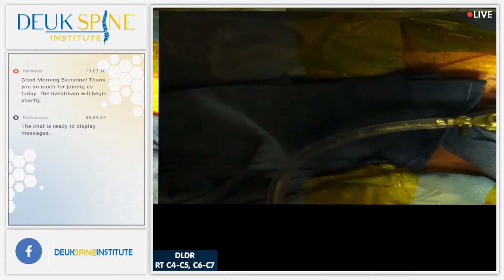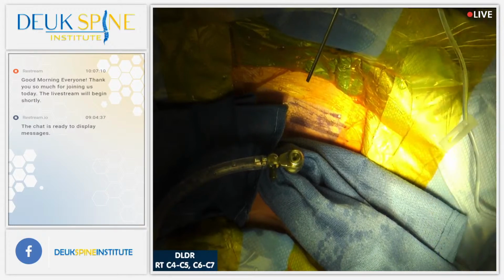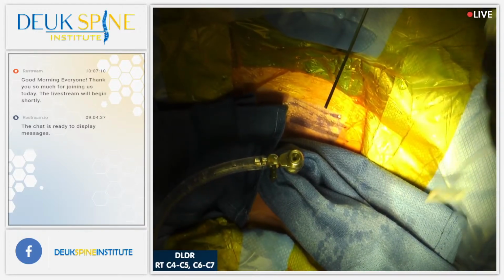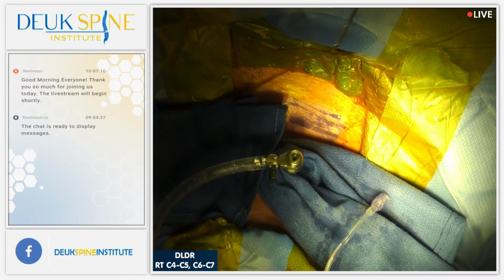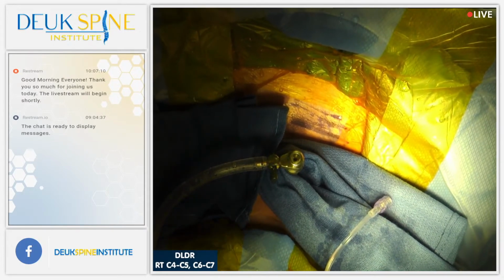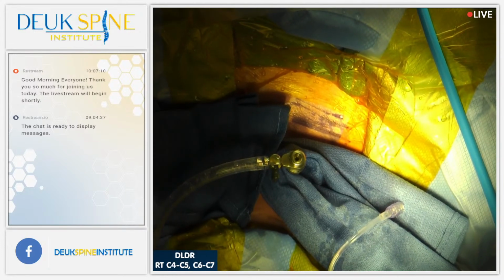Light off. Come on, guys, got to pay attention to what's happening. Nurses, whoever is in charge of scope, why is the scope still on? I need that scope. There's something probably with the scope.